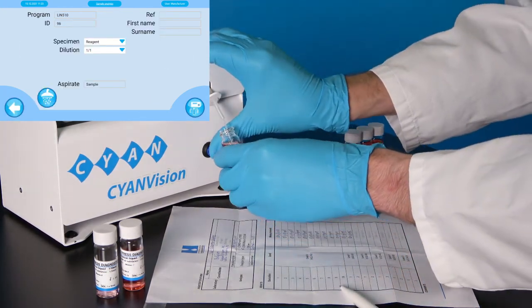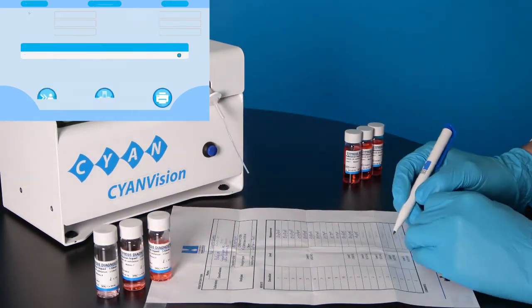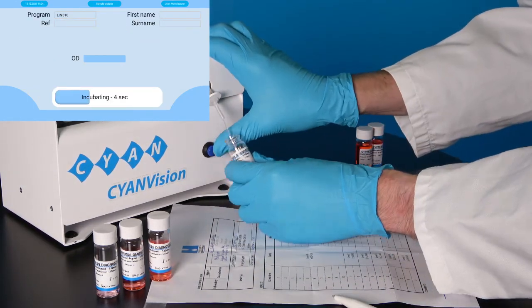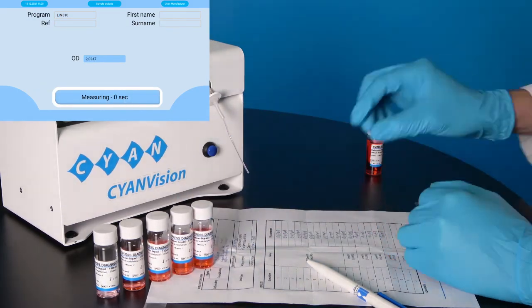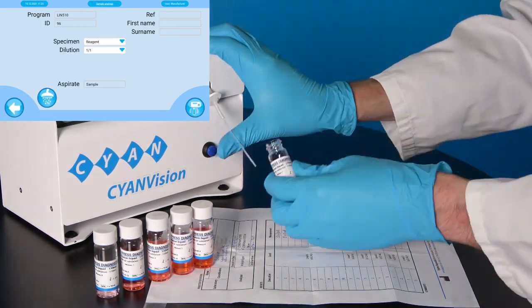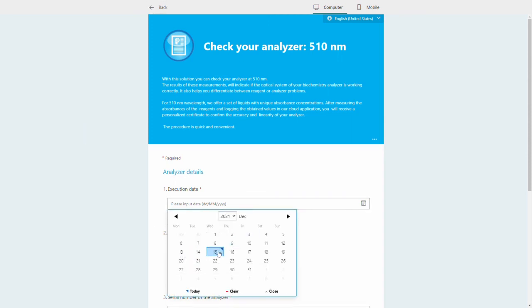Repeat these steps for the remaining levels. When all measurements are performed, go to our website by scanning the QR code or by selecting 'Report your measurements' and fill in the requested information.